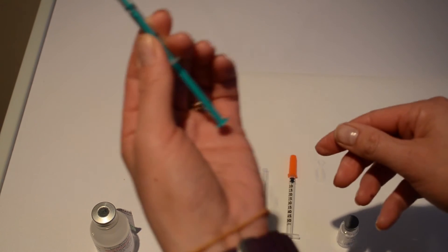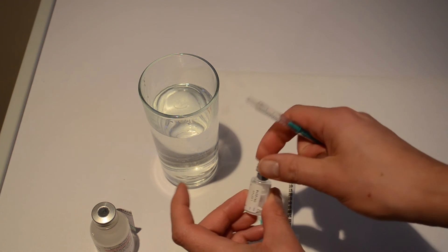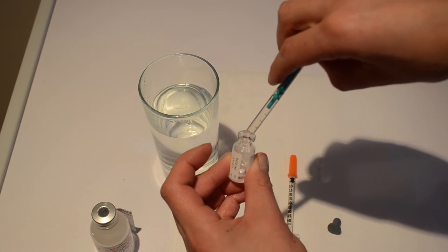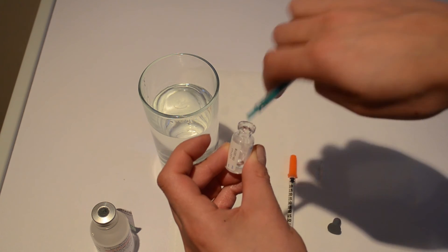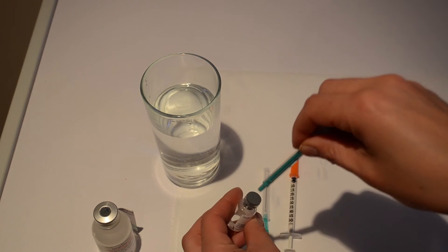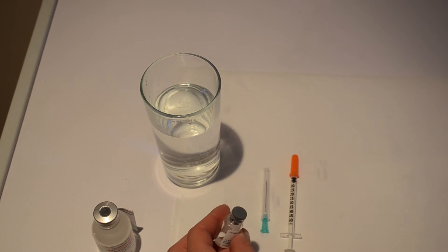Now of course what you're going to do is you're going to have your dummy AZZALURE vial and then you can deposit your 0.63 ml in here. Now in reality what you're going to do is you're going to have the bung on the top and you're going to put the needle into the vial.